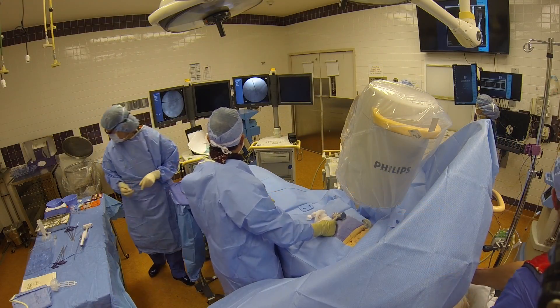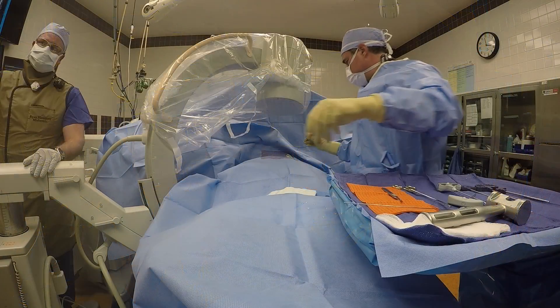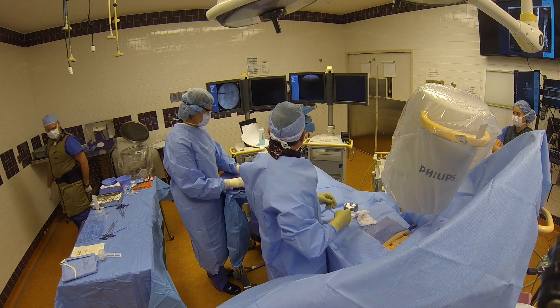The x-ray machine that you can see next to my head allows me to see front to back. The other machine, which is behind the blue sterile drape, allows me to see side to side.